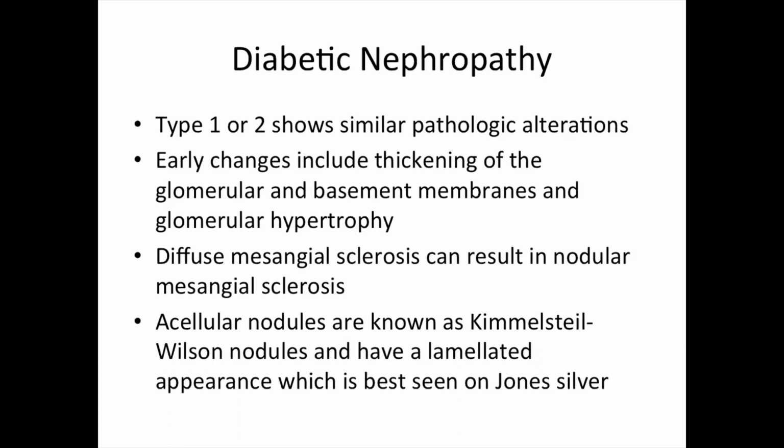But what happens in diabetes on IgG is that it only outlines the membrane, but it is not bright. It's not very intense. Anti-GBM is bright green, intensity of 4.